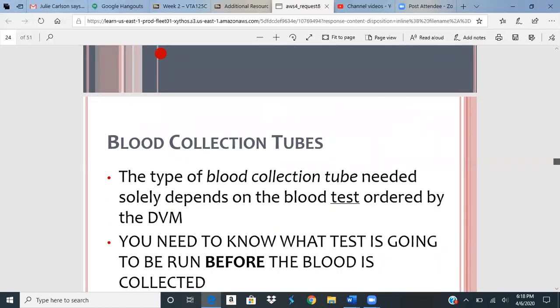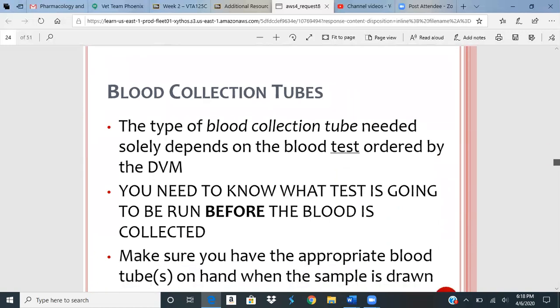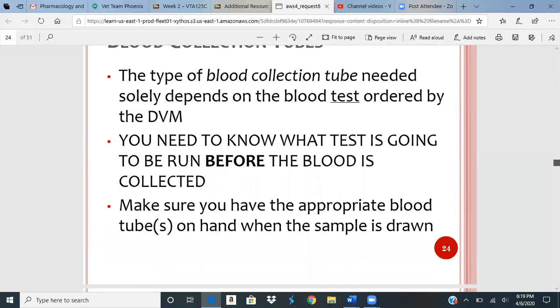And there are collection tubes. There are different tubes that we use depending on the test that the doctor is ordering. And you'll need to know, if the doctor's like, all right, I need to do a CBC and I need a chemistry, you'll need to know, okay, I need a purple tube, I need a serum separator tube. Those are the two I'm going to use. It all depends on the test you're running, what the doctor wants.